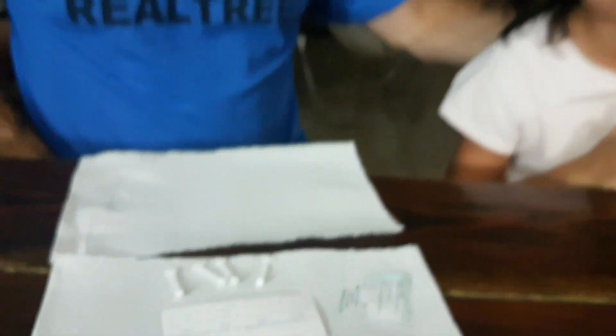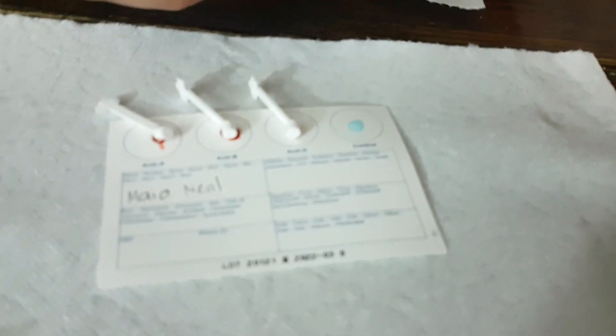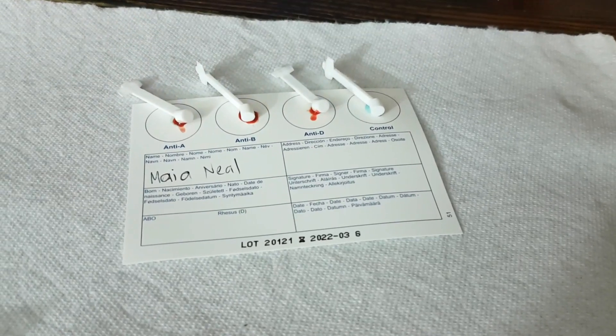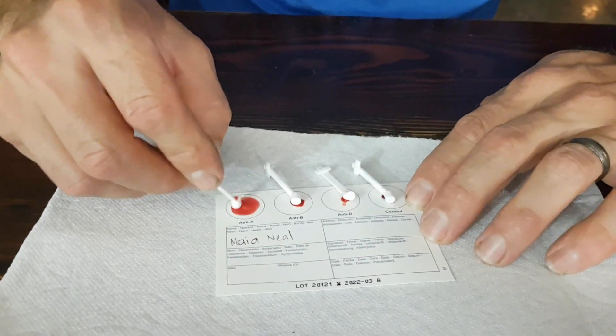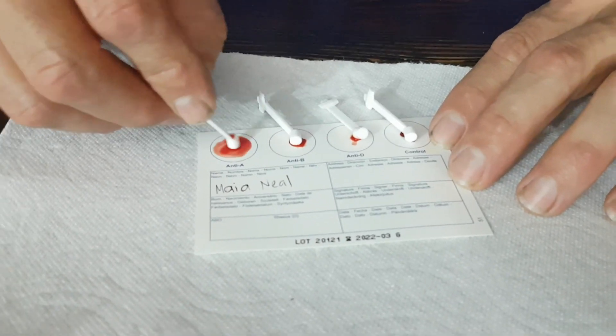It's time for Maya. Give me your finger — this one. We'll make it nice and clean so there's no germs. Same thing as the other ones — that's the last of the kids.